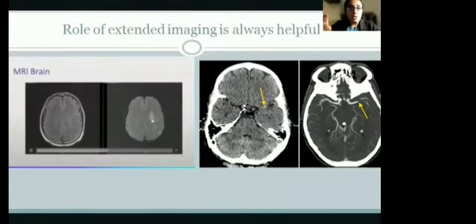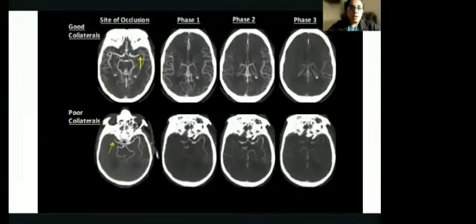And if we do the CT angio, you beautifully see the filling defect, which is the left MCA clot or thrombus. Now, if you look into the vessels, the distal branches as compared to the right and the left, you see that there is a paucity of vessels, which indicates what the blood flow is across that region and segment. Again, this is the time when you want to go ahead and thrombolyze these patients.